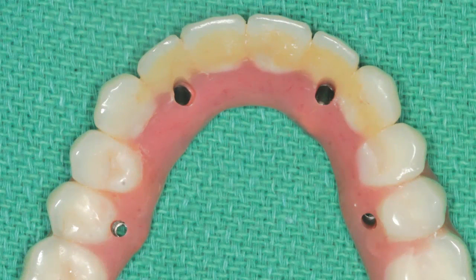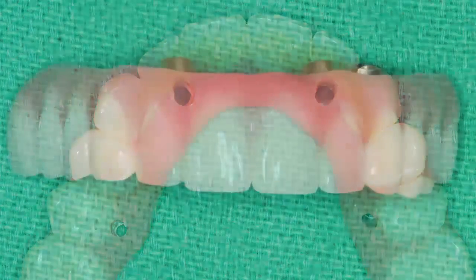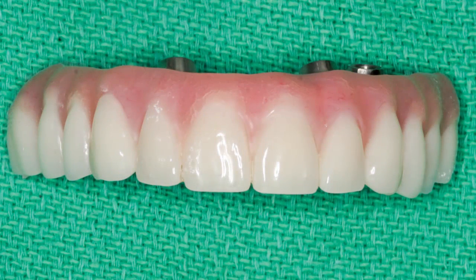Note the pronounced wear on the palatal surfaces of the anterior teeth. So long as the overall condition of the existing prosthesis is good and the patient and doctor are happy with its aesthetics, tooth positioning, occlusion, and function, the appliance can be used as a blueprint for the new restoration.